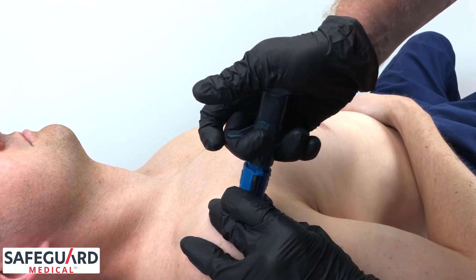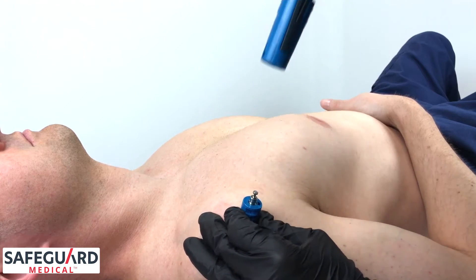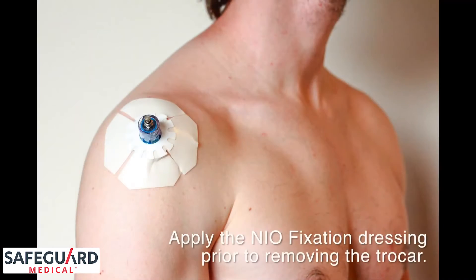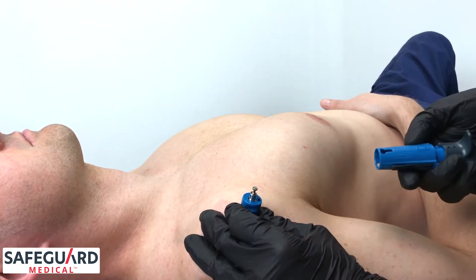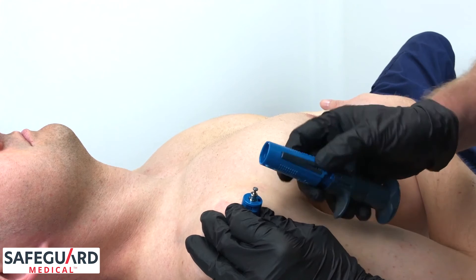Once the neo has deployed, remove the device while leaving the stabilizer base in place. The trocar can now be removed either by hand or utilizing the trocar removal notch.